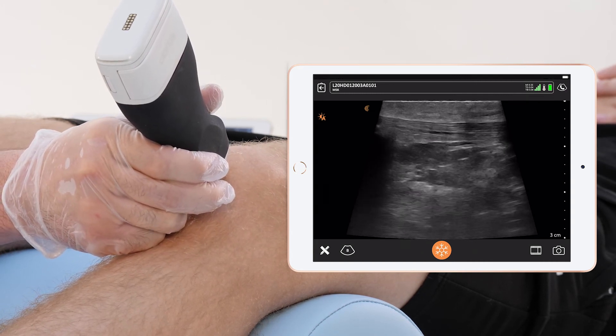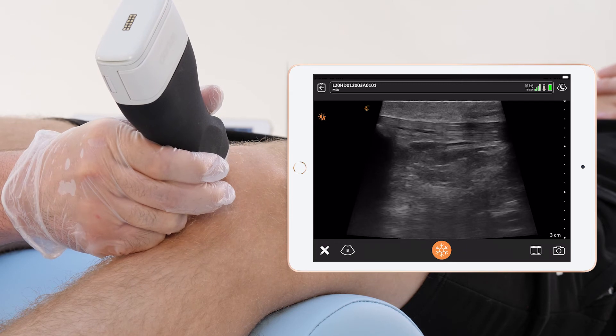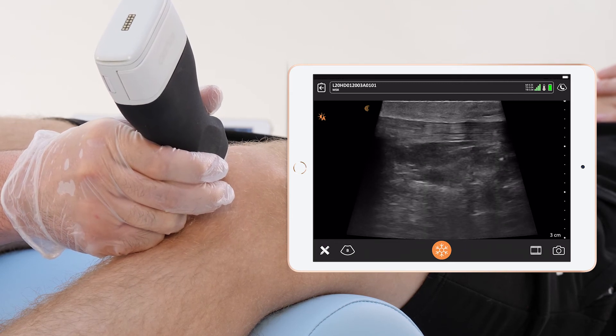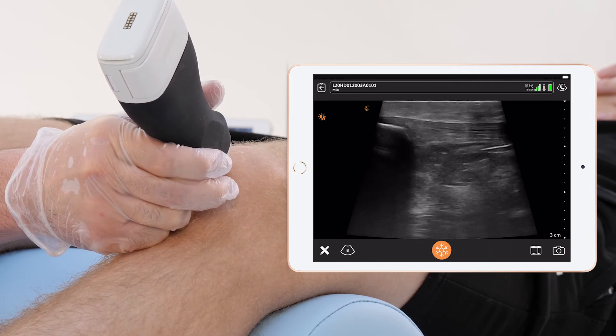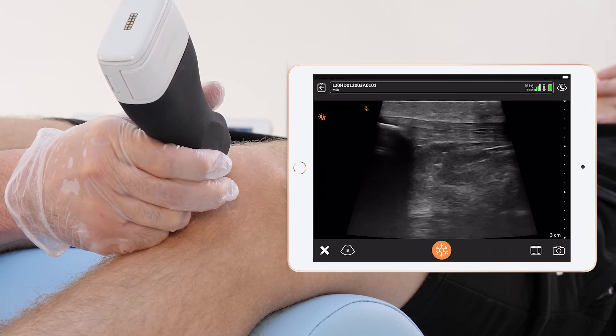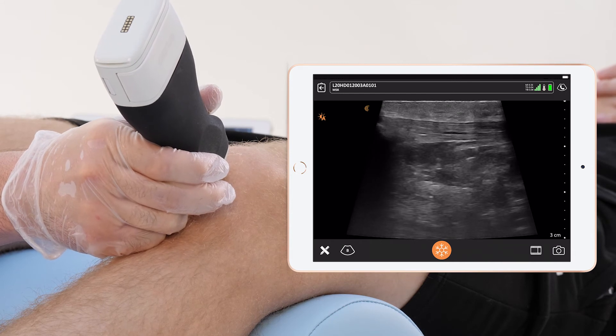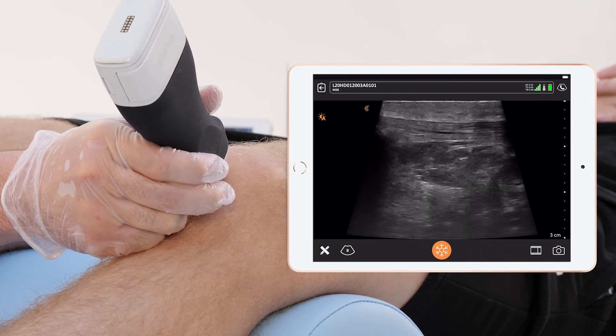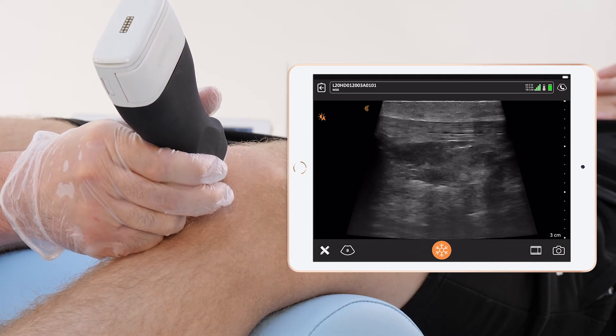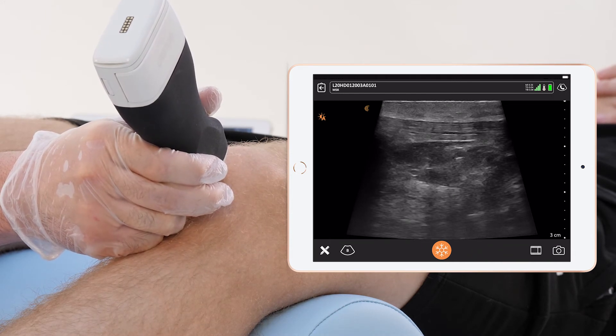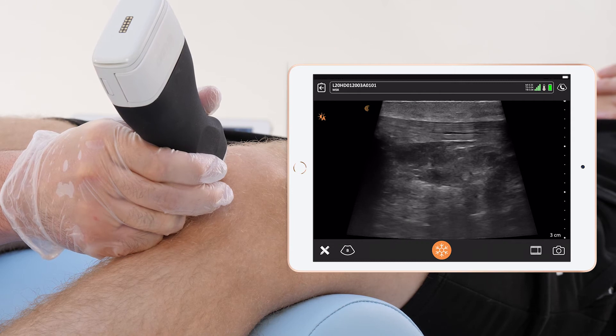In this case it seems to be a partial tear. We can also check with Doppler measurement to see whether there is any sign of neovascularization.